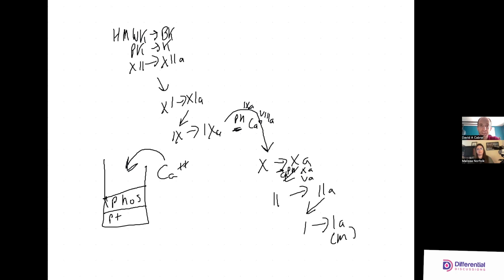After adequate time of incubation, the analyzer or the technologist is going to add calcium. This is a critical starter reagent. As soon as that calcium hits that cuvette, the reaction and coag stuff starts. It is typically at this point that the analyzer will start its own internal timer, right? Eventually, we'll work through this cool cascade and end up with fibrinogen converted to fibrin, and a clot will form.